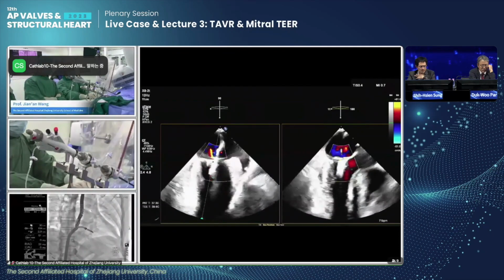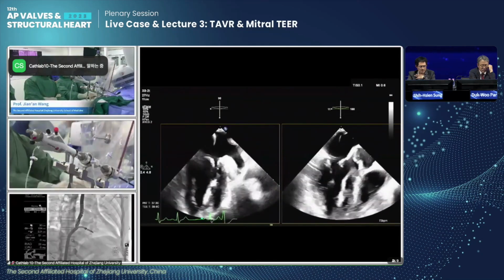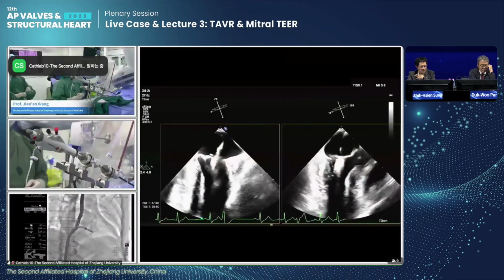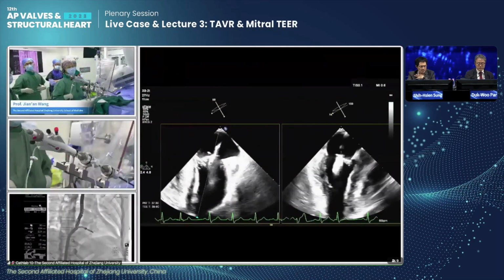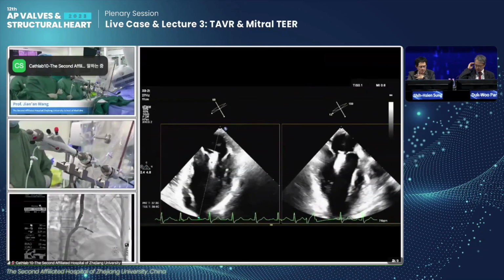我觉得你今天这个切面不对呀。信号小没有关系，把bicommissural view先打出来。切的时候没有把那个edge打出，打到主动脉根部去了。Yeah, we have to go more lateral. Much better.